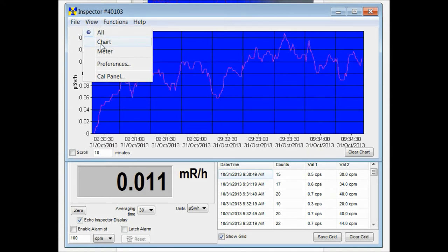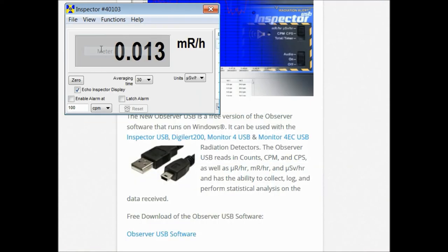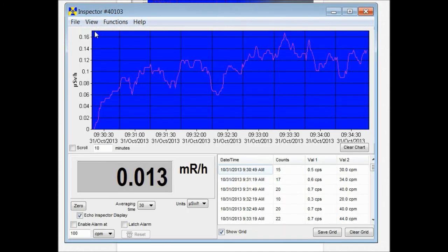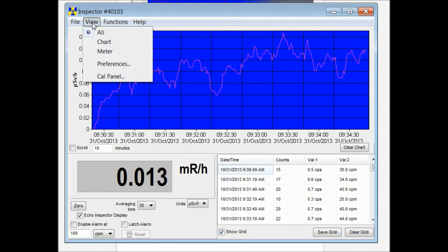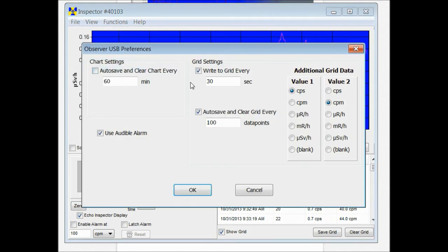Now you can change the view so that you see just the chart or just the meter. Personally I like to see them all at the same time. You can also change the preferences.